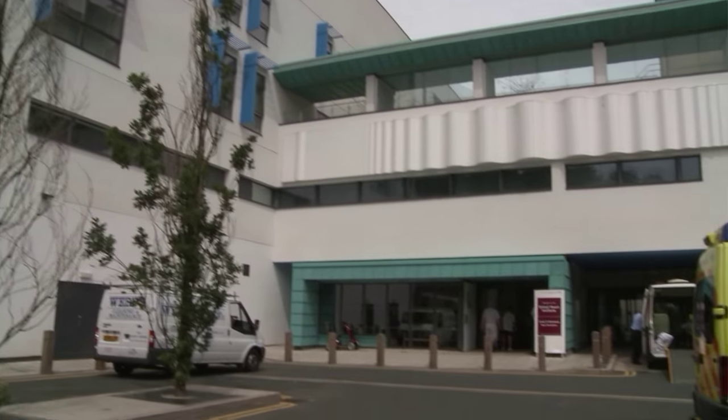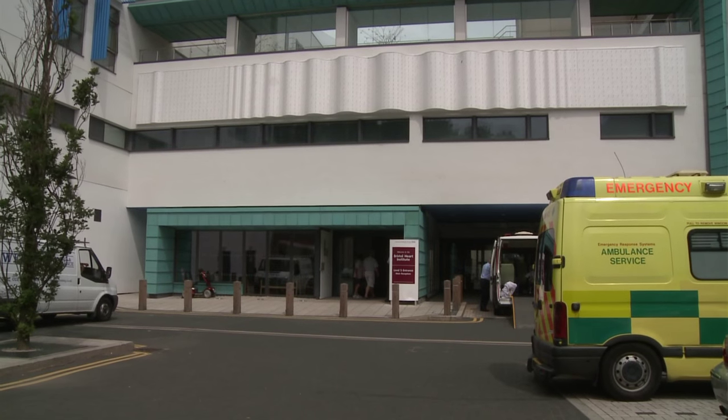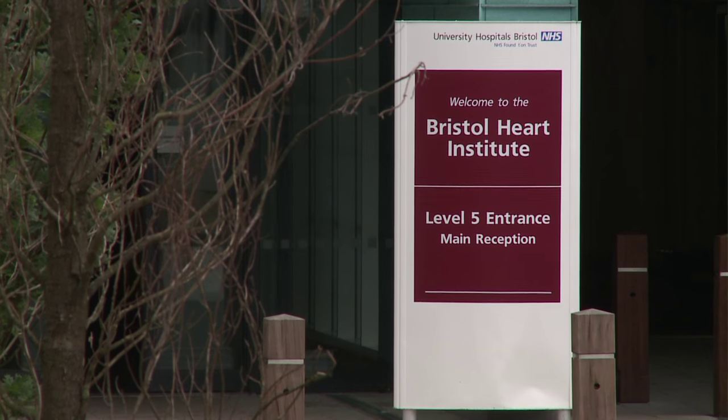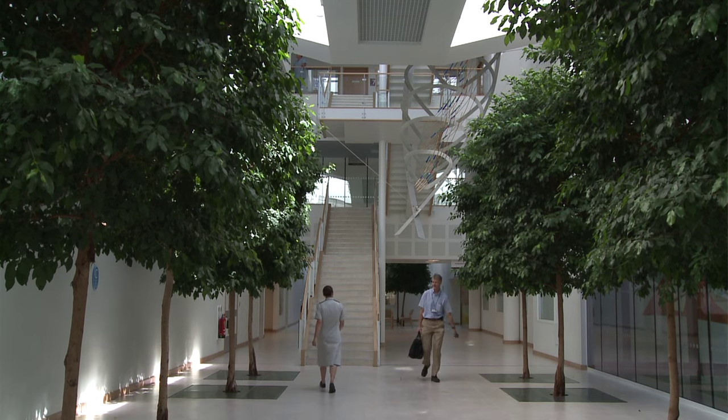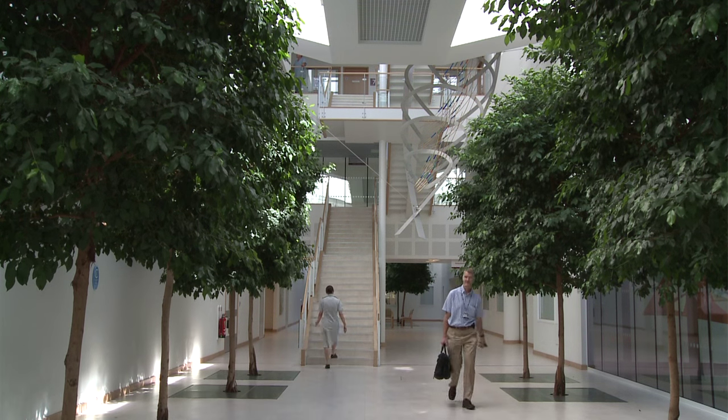Welcome to the Bristol Heart Institute. My name's Tom Johnson, I'm an interventional cardiologist. Here in Bristol we undertake a whole array of complex intervention, approximately 1,600 procedures a year, and 75 to 80% of that activity is undertaken via the radial artery. Today we're looking at performing patent haemostasis withdrawal of the radial sheath using the Terumo TR band, and I'll take you through the steps we undertake here at the Bristol Heart Institute.